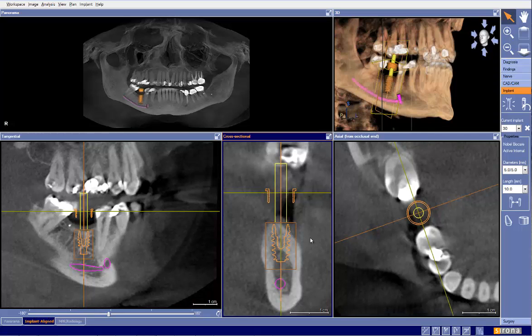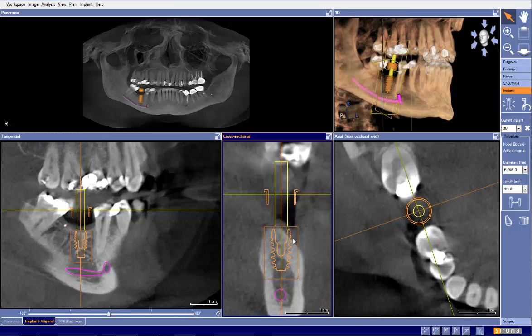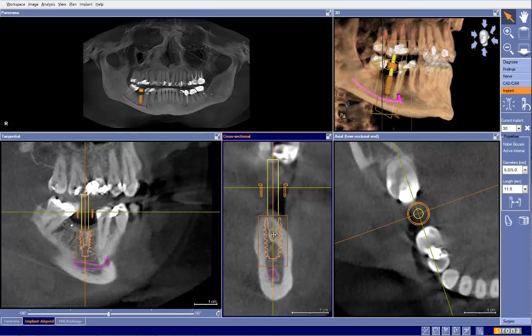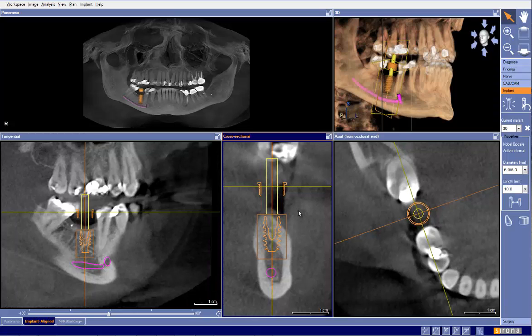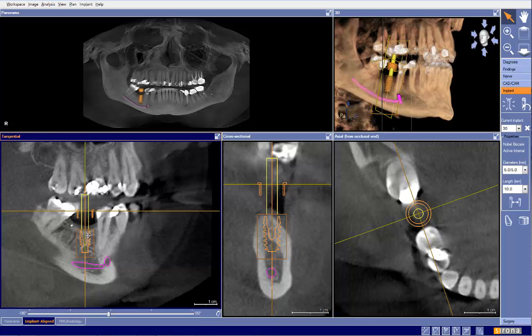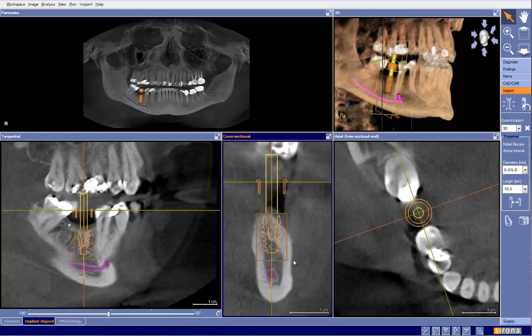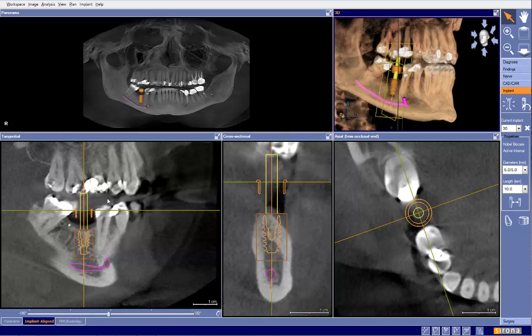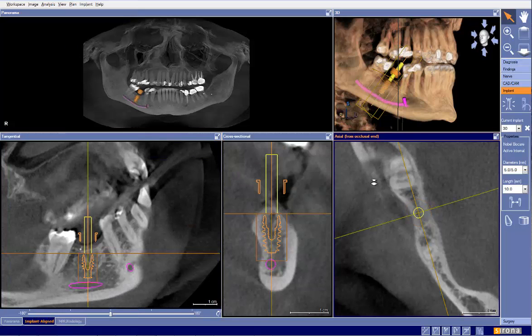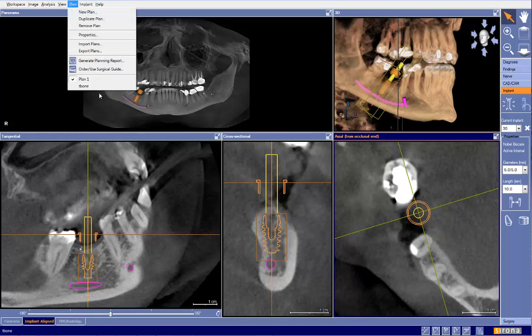So now we have a much better position. The negative is that due to bone resorption, we've got a little bit of the implant showing. I have the space to go to a longer implant if I would like, but a 10mm implant is more than adequate enough. So now we have a better, more ideal implant placement here. If we go through to the original plan, we can definitively see how different this looks, especially in the tangential view and cross-sectional view compared to my more idealized plan.